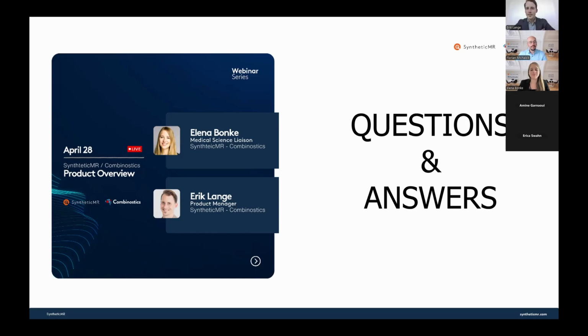Good question. That depends, of course, a lot on your user profile. But I think for SyMRI, we have a lot of customers in the academic medical hospitals that have one foot in the clinical world and one foot in research. And the ability to use the quantitative data, both for clinical practice and for really advanced research, is probably one of the key customer needs or values that we provide, if you're that kind of customer.